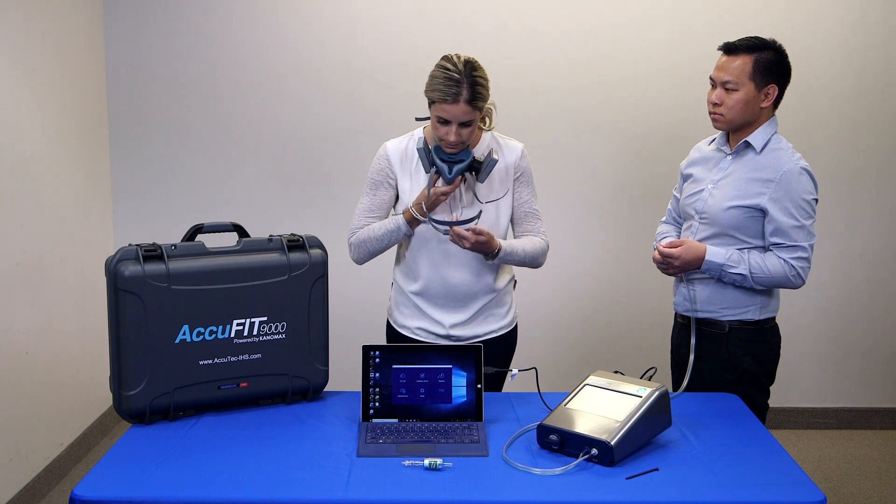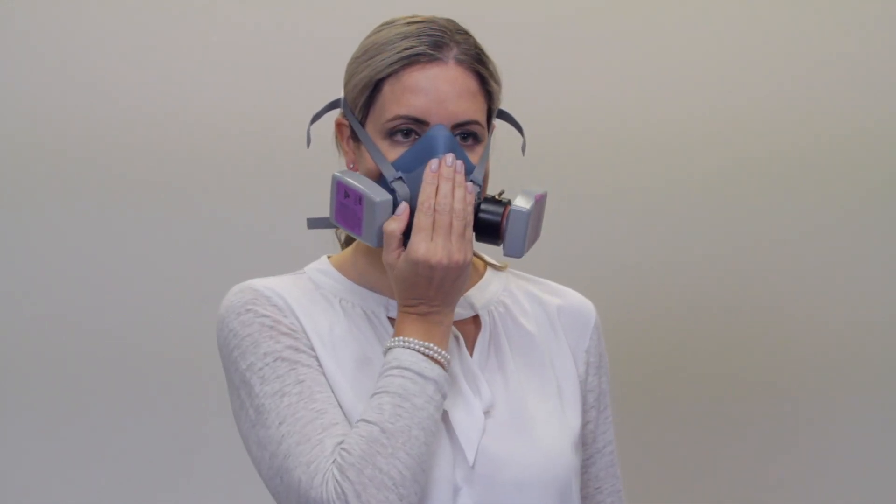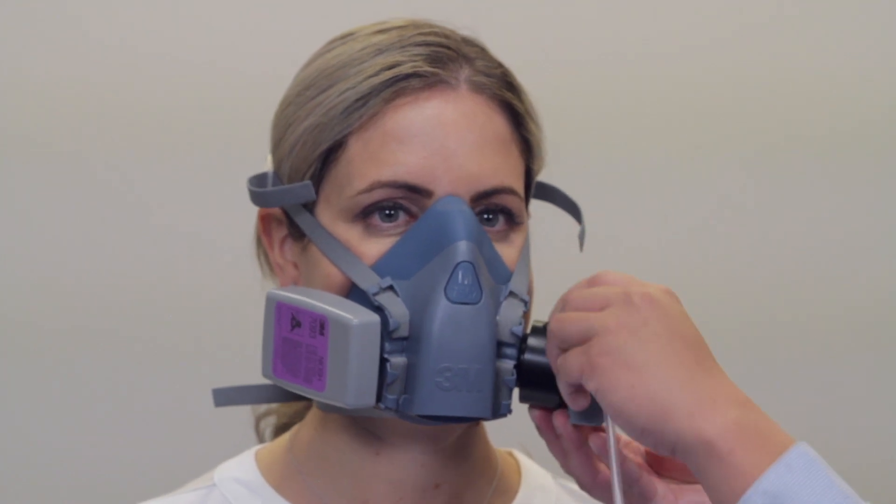You are now ready to conduct a respirator fit test. Have the person being tested don the respirator and perform user seal checks by themselves and confirm that they are wearing the mask properly. Prior to the respirator fit test, connect the respirator to the sample inlet of the device with the appropriate fit test adapter and twin tube.